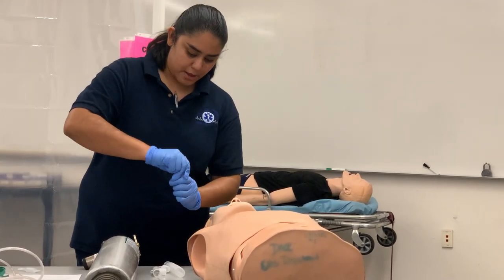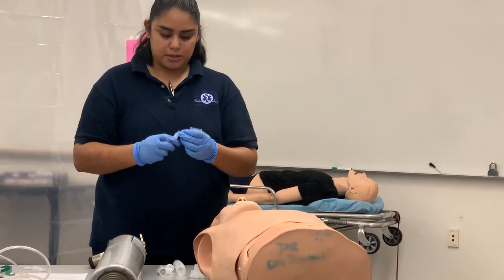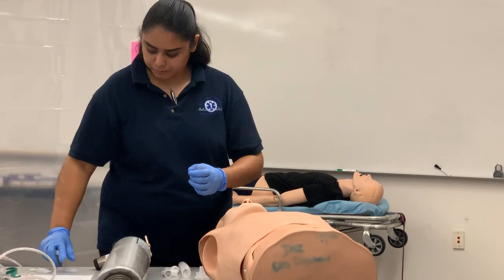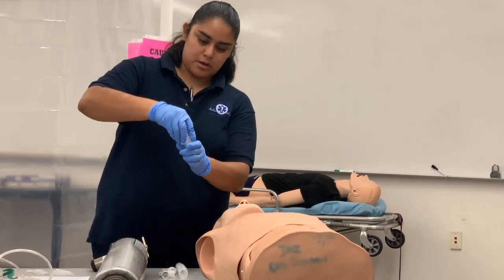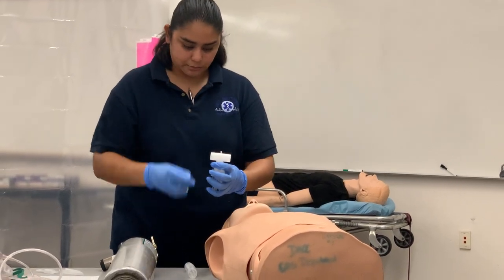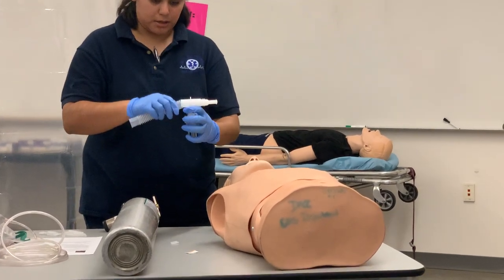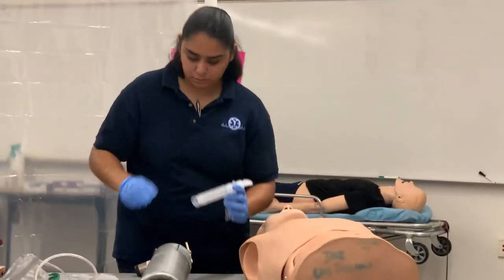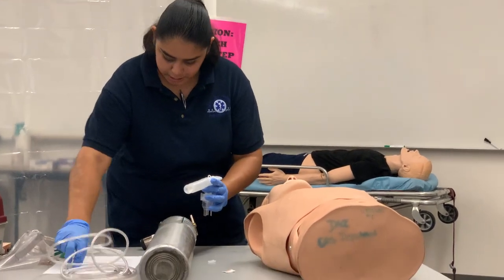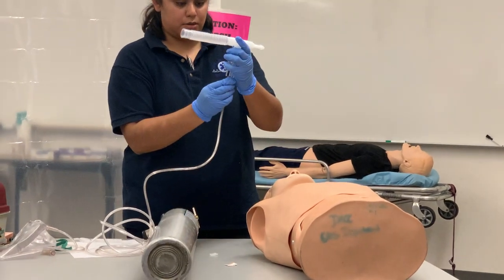I'm going to take the top off the medication and take the top of the chamber, then squeeze it in. To recap: you're going to use a T-piece, mouthpiece, and your tubing. You're going to put one side of the tubing to the O2 tank and the other side goes at the bottom of the chamber.